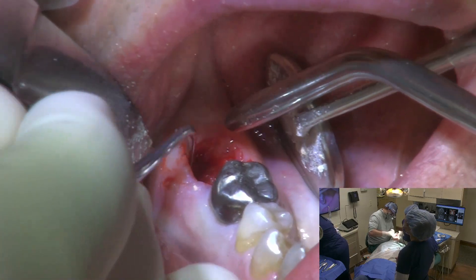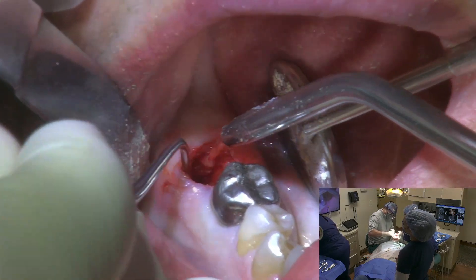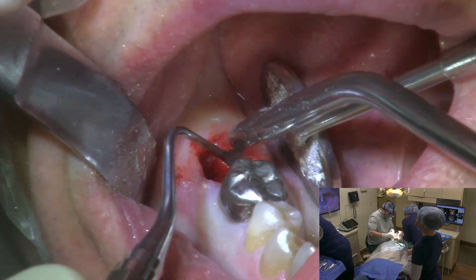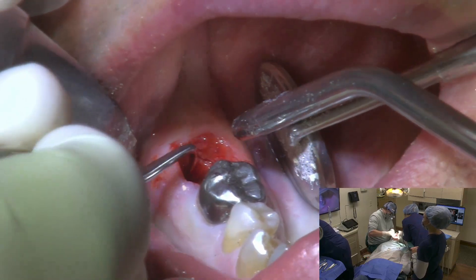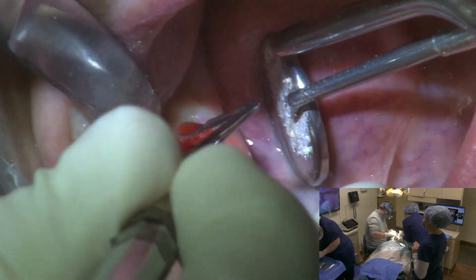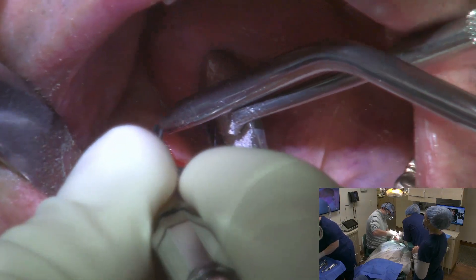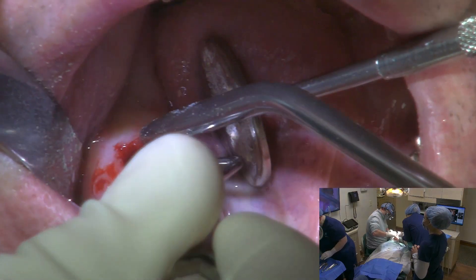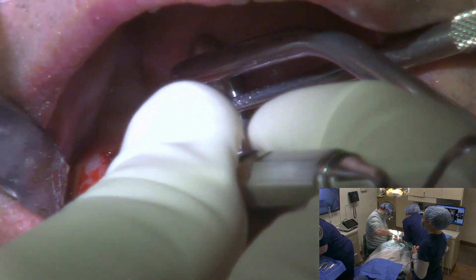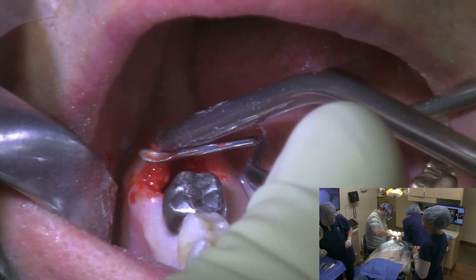This is one sick little tooth. All we're cleaning out right now is just all that granulation tissue. We're trying to figure out what's going on with the bone and this infection. We can see here our communication — loss of bone is what I'm really concerned about, as to whether or not to put an implant in today or wait. That's what we're analyzing right now as we're cleaning all this soft tissue up.